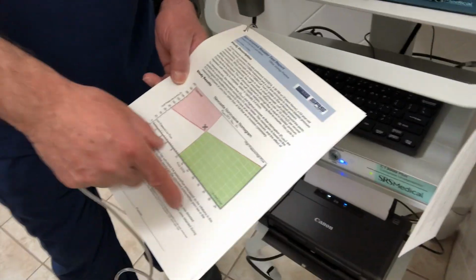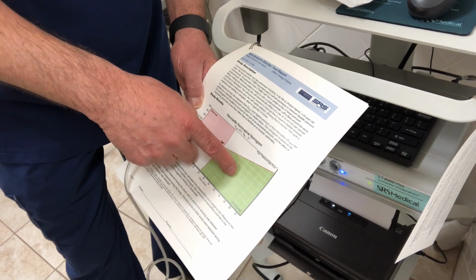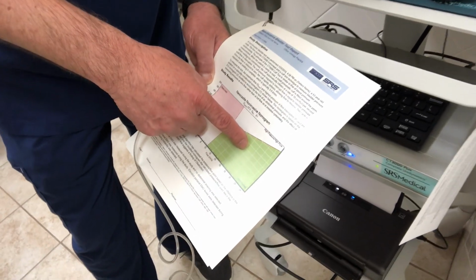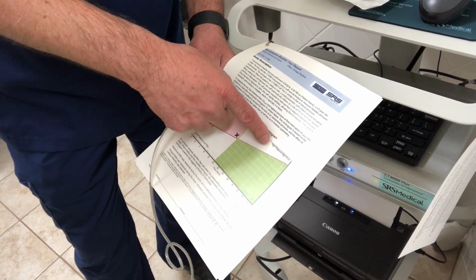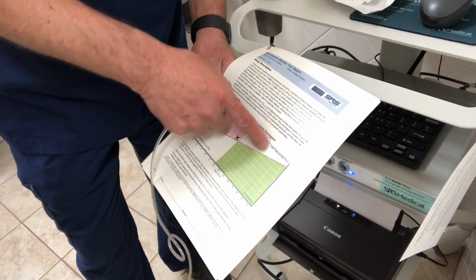So a quick example, initial patient essentially will come in and he's going to score, just beginning to have symptoms. He may have an elevated pressure, but still what we would consider a normal flow and a normal pressure. Once the obstruction increases, this will move the bladder to compensate into having to provide higher pressure to maintain the same flow.